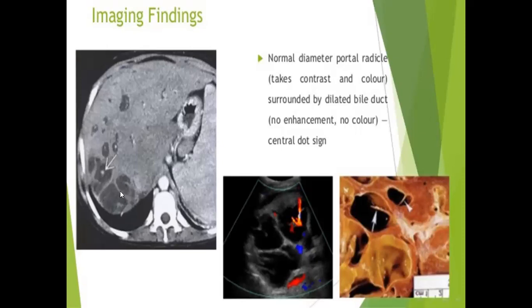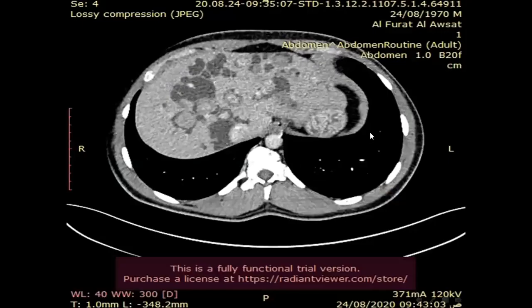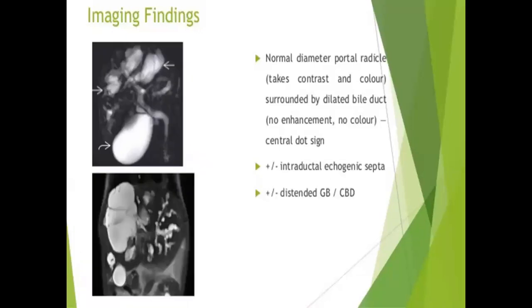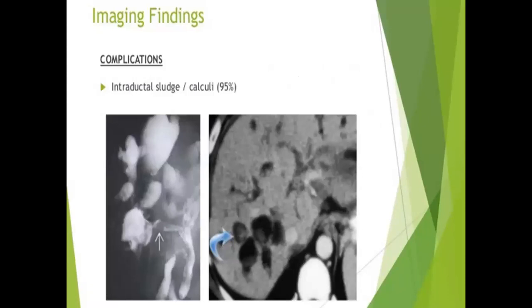The central dot sign: on CT you can see enhancement of the portal radical, and on ultrasound you can see color Doppler signal. In our case, the central dot sign is present, with dilated biliary tree, portal radicals, intraductal septae, and distended gallbladder and CBD. Regarding complications of Caroli disease, intraductal sludge or calculi occur in 95% of cases.